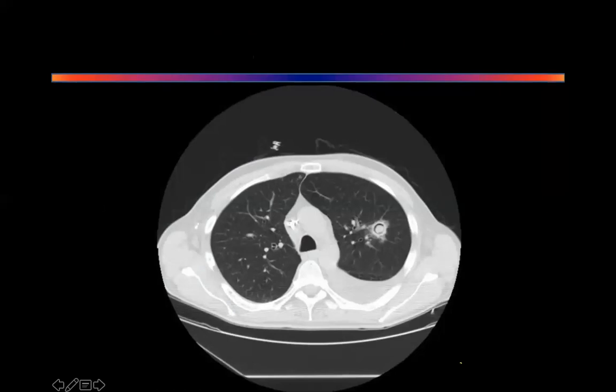Yes. So this is a CT scan lung window in a transverse section, which is showing a small cystic lesion in the left lung, most probably upper lobe, showing an air crescent. Also there is a left-sided pleural effusion, which I can appreciate. You seem to forget this fellow all the time. So the fungal ball, basically. There is a ball seen within the cavity. That's why in the last CT or X-ray also I was pointing it out. So you have to describe this. This is quite important. It's the classical sign of aspergilloma. Agree? Yes. Okay. Thank you very much.